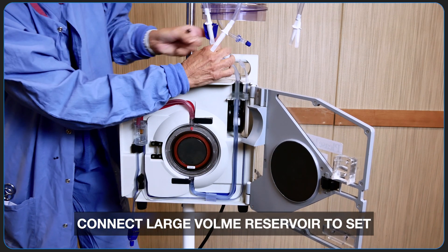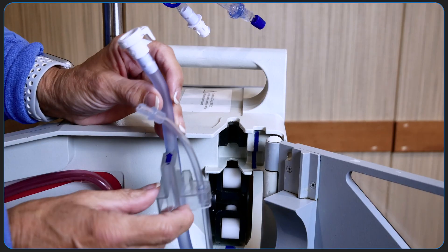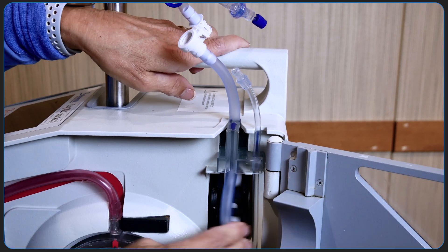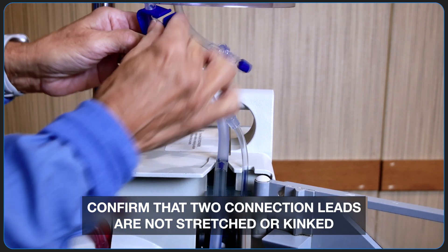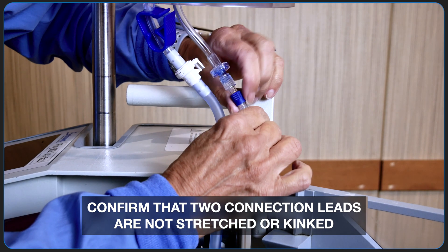You can now connect the large volume reservoir to the two connection leads at the top of the circuit. This is a close-up of the interlock block, and you can see how it sits right on the shelf of the fluid out air detector. As you connect the reservoir to the circuit, make sure that the two connection leads are not stretched or kinked, or you may experience flow restriction and fluid out alarms.